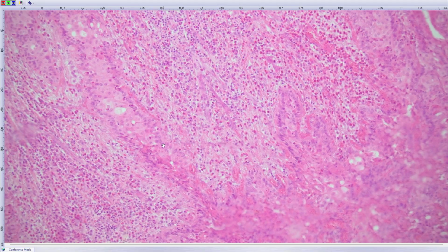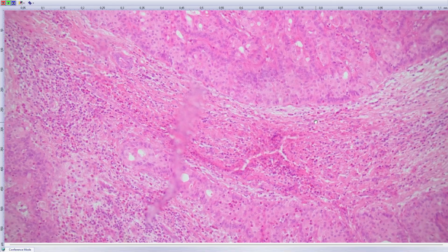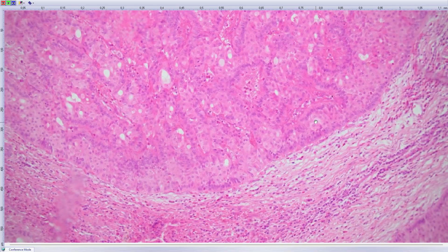this type of polarity. You see the glands are opened upside down. These tumors are known in kidney. In kidney they are called papillary carcinomas with reverse polarity. You see the polarity is open to the stroma.